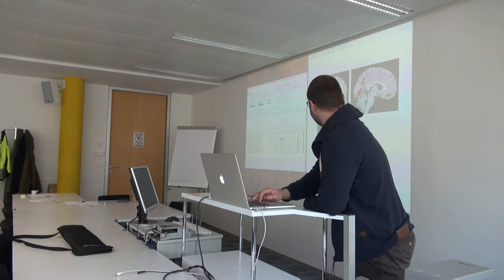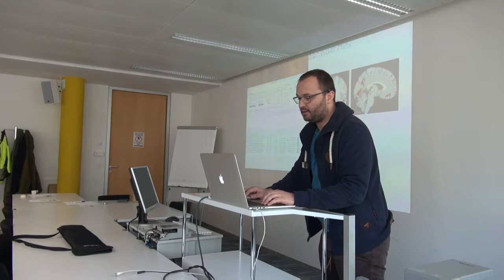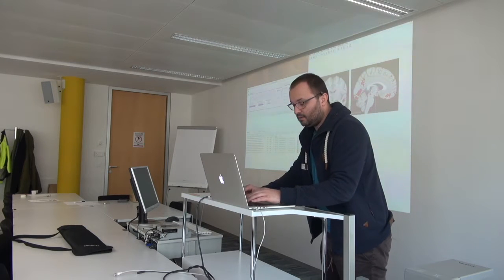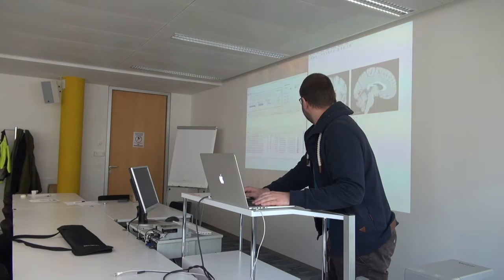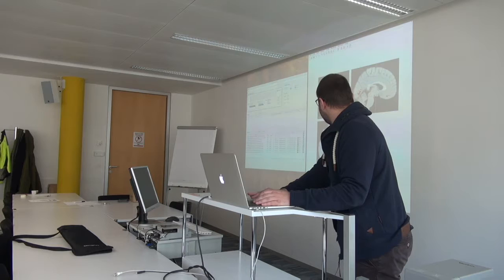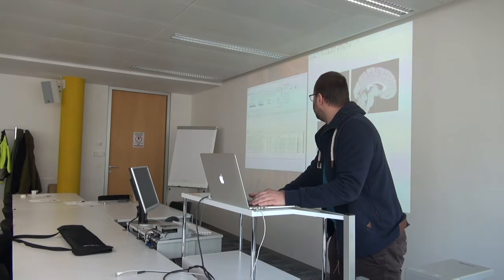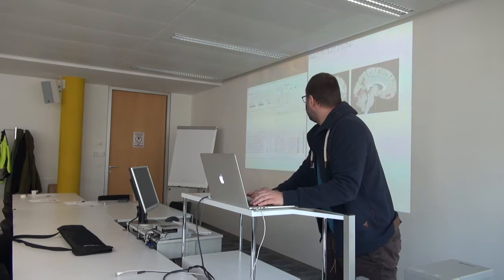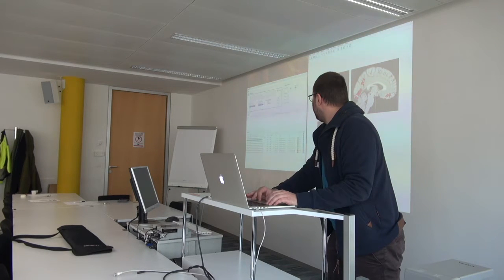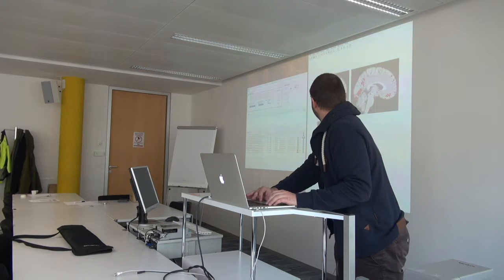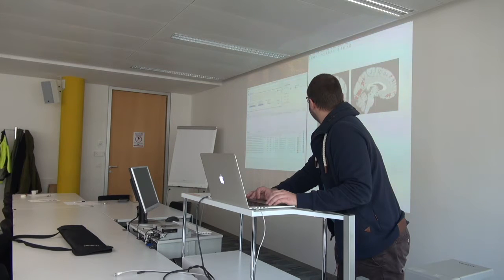Here we see that the threshold is set to 3.15 — that's the uncorrected p-value of 0.001. I can easily change the threshold and you see how it changes. If you wonder why the T-value is so low, these are unsmoothed data of the amygdala — an unsmoothed group result. You can see a variety of overlays with differently colored masks. Let's take the green mask for the left amygdala — you can easily toggle them on and off.